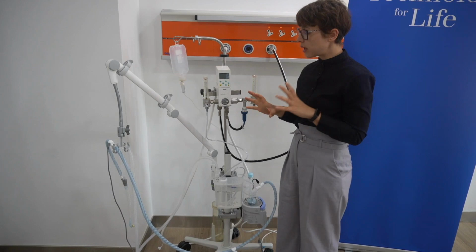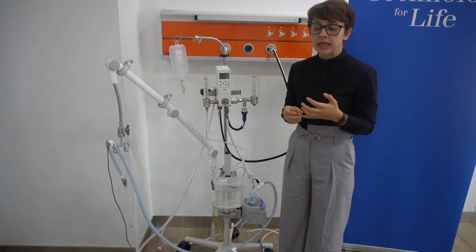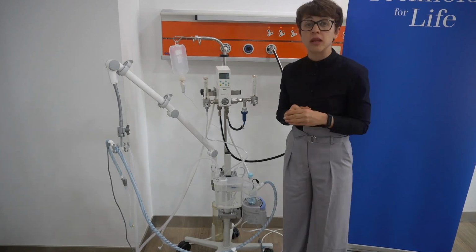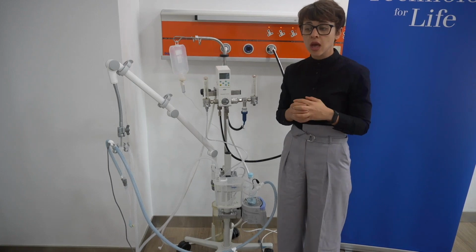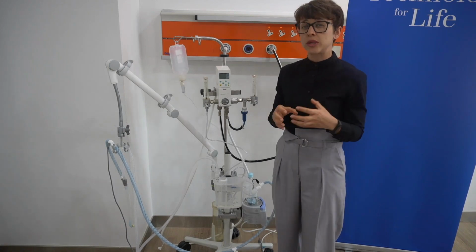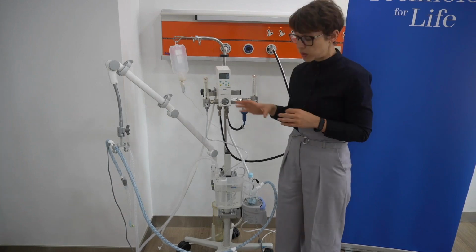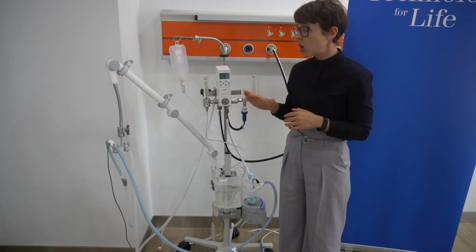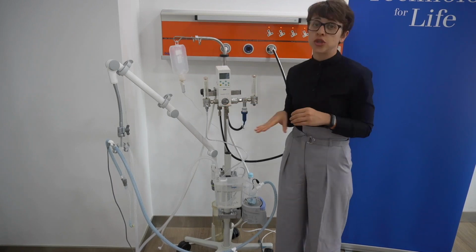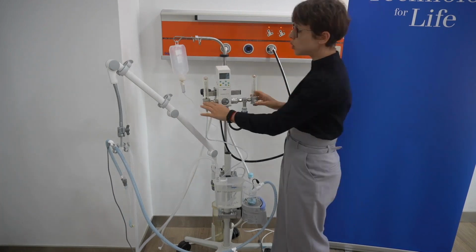So I think Linda, you can mention, but we would consider starting the resuscitation, and I think we covered this topic during the last lecture in resuscitation, that we would rather start with a lower oxygen concentration, about 30%, and then see how the baby responds to this. The same would apply to the Seattle Bubble CPAP system. We just have to be quite careful on the oxygen FiO2 settings.